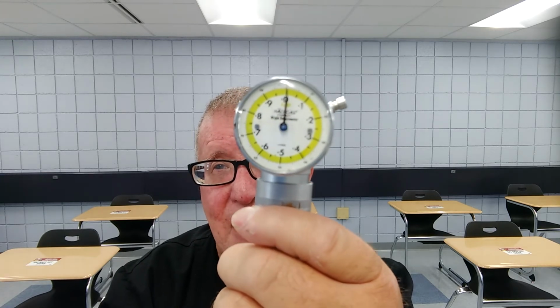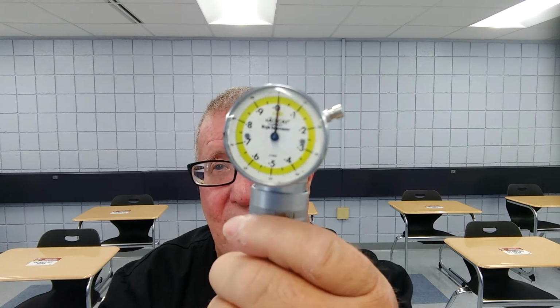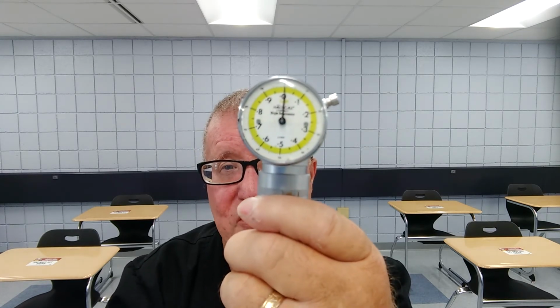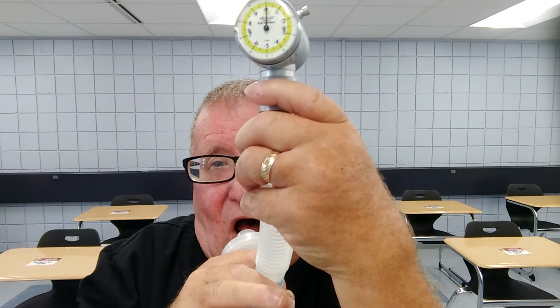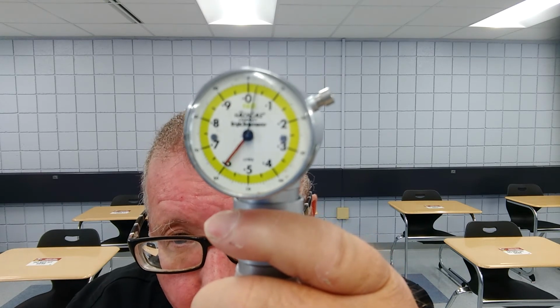And then at that point, the air that's left in your lungs is called the residual volume. You will be learning that in upcoming semesters when you do pulmonary function test, but you might as well get some of the words now. So again, have the patient take in a deep breath in as much as they can. Blow. Take it off. Okay, I can't get any more. Attach them back to the ventilator.